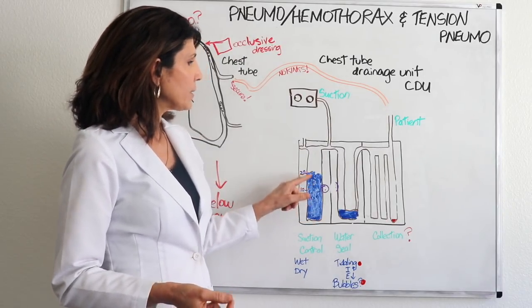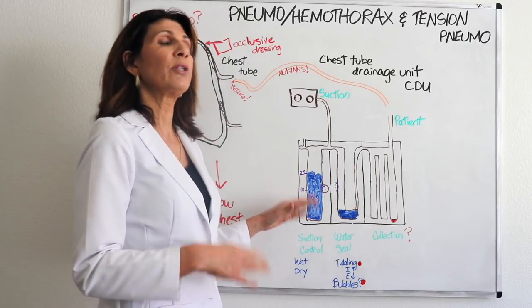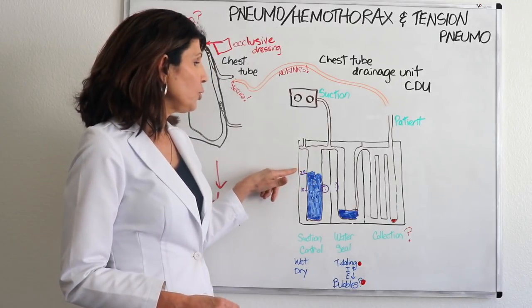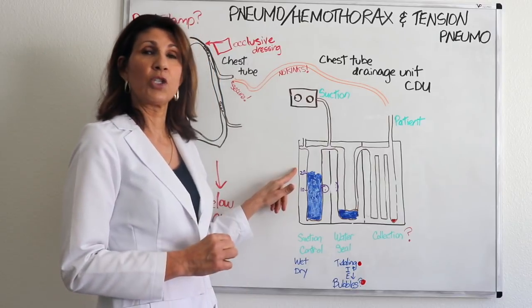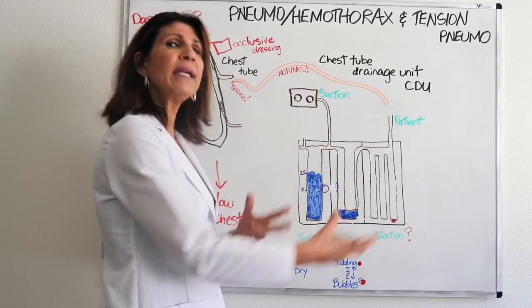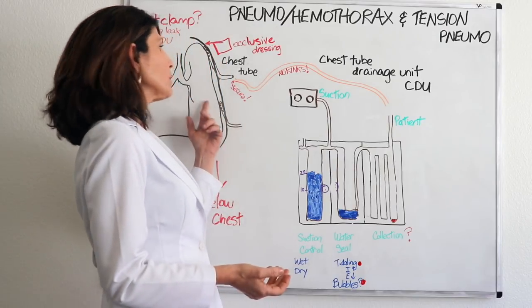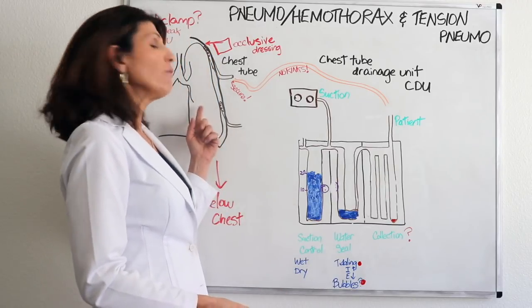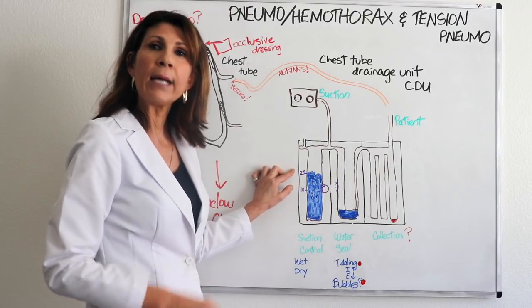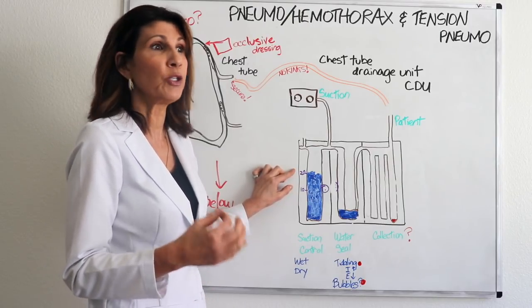This one demonstrates a chest tube drainage unit where we're using wet suction. We'll mention the implications when it's called a dry suction container, but you'll still see lots of wet suction containers out there. With a wet suction container, you have to fill this to whatever negative suction pressure is prescribed for the duration of having the chest tube. What do I mean by that? Well, having negative suction pressure applied to the pleural space will expedite the chest tube coming out, and will expedite the resolution of whatever the reason is that you have this chest tube. So you want to make sure that it is at this 20 centimeters of water pressure line, which is generally the suction pressure applied if that's what's prescribed, or else you're not doing what you need to do.